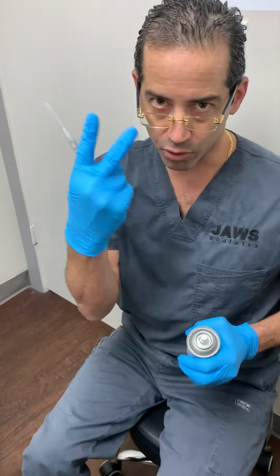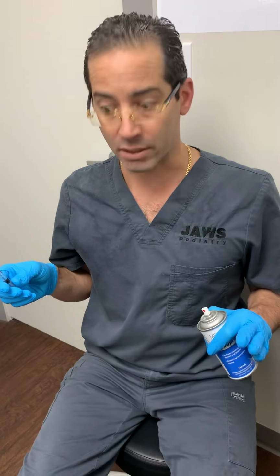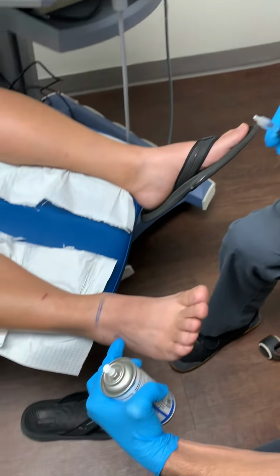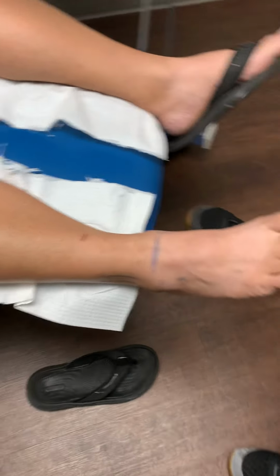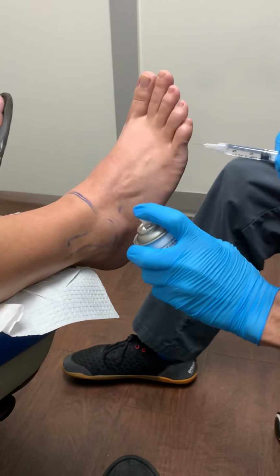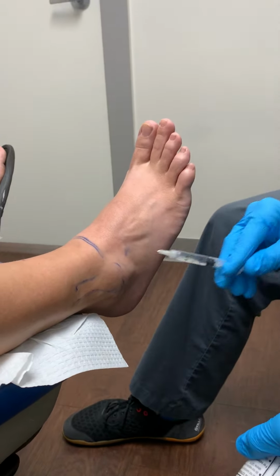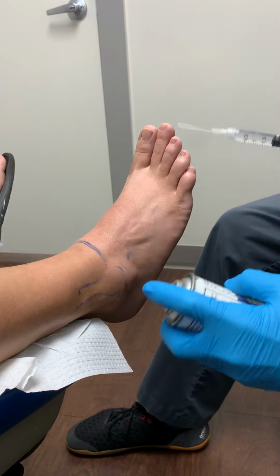Numero uno. Numero dos. We're going now into the subtalar joint. You see how it's a little bit lower than this one? Right? Because the joint is underneath the ankle joint. There's two ways. A lot of people just go in this way. Some people go in this way. Some people go in this way. Okay?